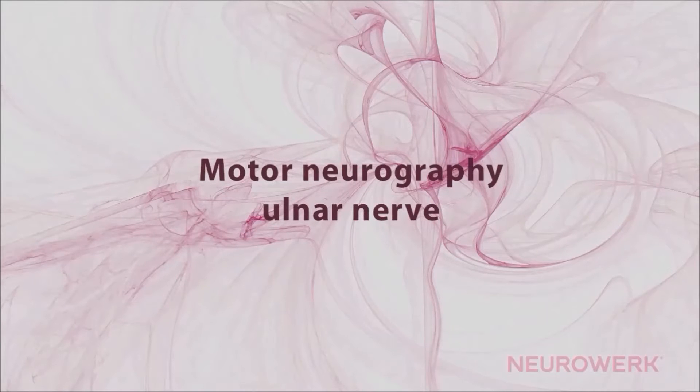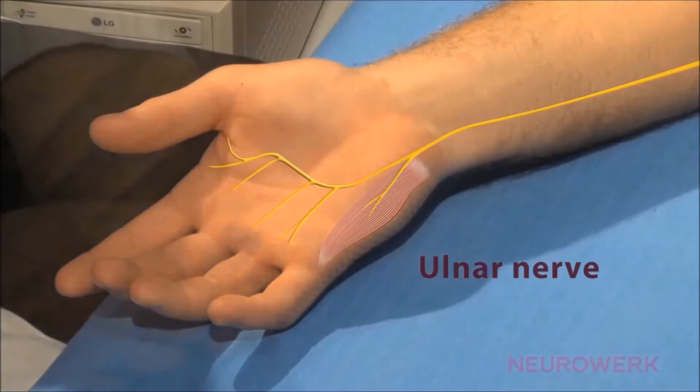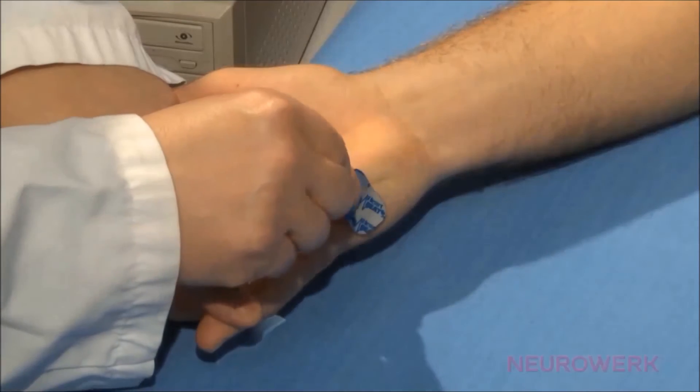Motor neurography of the ulnar nerve. On the motor ulnar neurography, the different or active electrode is positioned above the venter of the muscle of the hypothenar, this is the so-called abductor digiti minimi muscle.